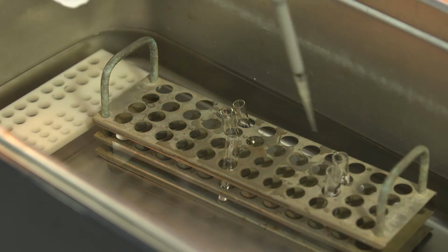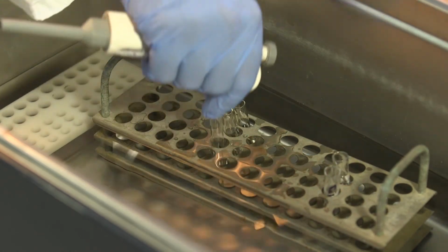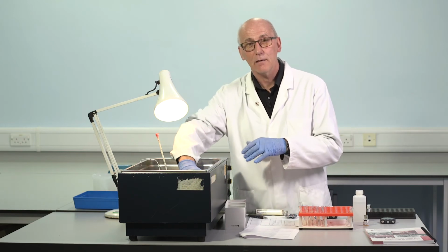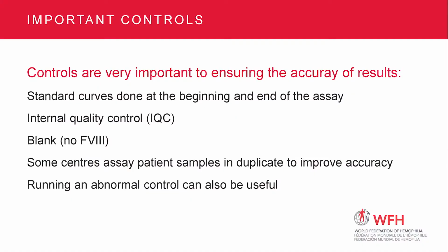So during the assay, the very first sample we tested was reference plasma, calibration plasma, and the very last is a repeat of the same reference plasma. New dilutions, but the same reference. So what's the purpose? We need to know if any of the conditions have changed during the assay. Whilst I'm talking, whilst I'm pipetting, have I introduced contamination between any of the reagents? Has the water bath stopped working during that time? Have I turned it off by mistake? There could be changes during the period of the assay.